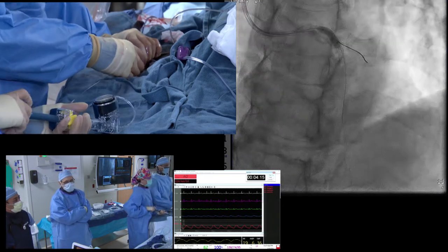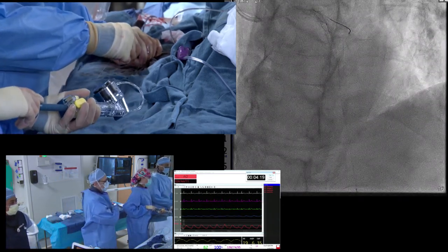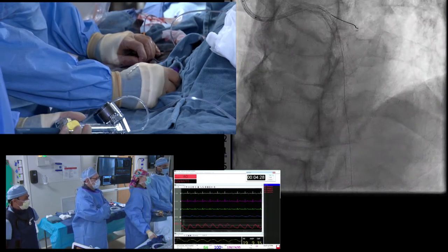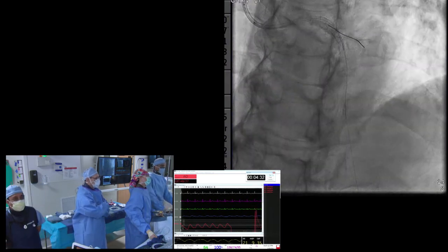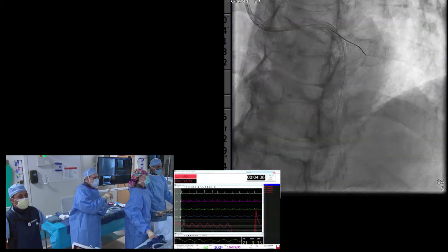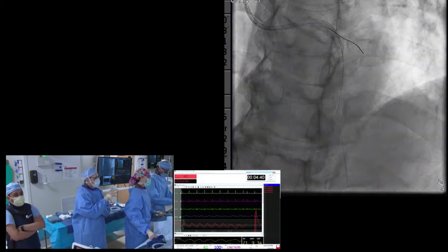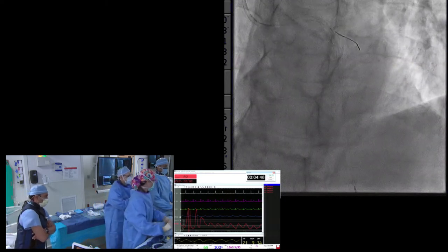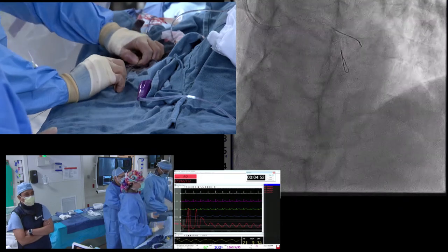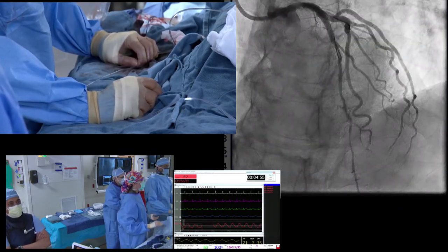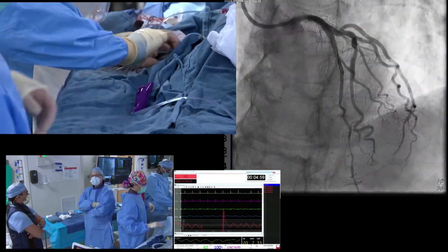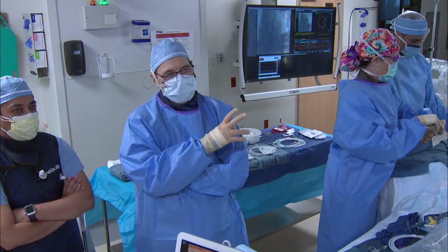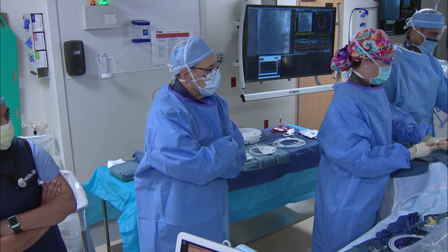We've done the 4.0 NC post-dilation. Let's do a final angiogram in both cranial and caudal angulations. That's gorgeous! Let's just pull our wire back to about that diagonal to make sure that distal spasm goes away. I think I'd leave that alone — that's going to recover fine, likely just wire-induced spasm. We can throw some nitrates down the vessel.